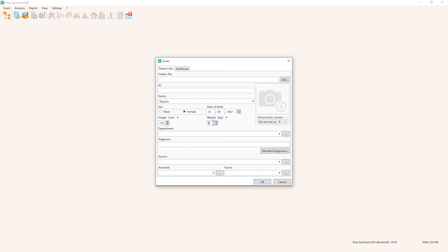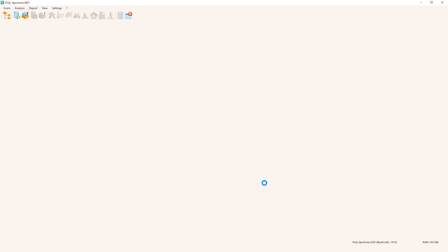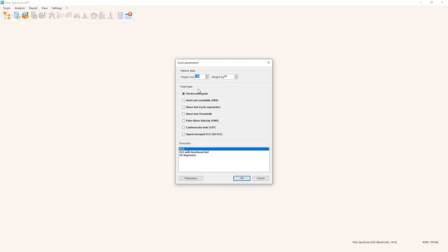So I remember this patient a little bit. We met before. And wait. So I'm setting birth date, height, weight, that's for statistics and for some calculation that is performed during the test. Next step is to find proper exercise protocol. For example, today we're gonna use this World Health Organization multi-stage test.